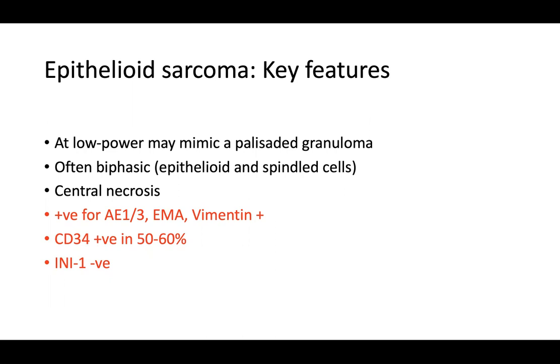So you could stain for CD68 rather, and CD163 just to highlight histiocytes and make sure you're not dealing with epithelioid sarcoma. But it comes down to looking at the cells, looking at the overall architecture, looking at the extent of growth. And the INI1, I would say, is key. You probably shouldn't sign out an epithelioid sarcoma unless you've done all of these stains here, at least the keratin, CD34, and INI1.